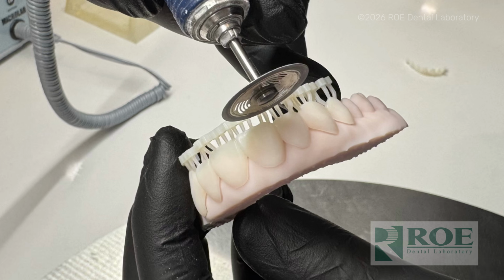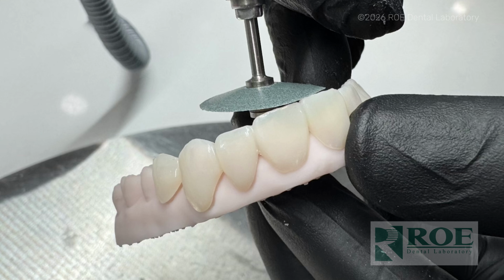So what I always do is, I'll usually be able to print a model. If you have two printers, you can print a model and that makes it easier to process. But I'm going to use a disc wheel to remove the supports, because if you just tear these supports, sometimes it'll create a little divot, and these are on the incisal edges. So I don't want to change my final prototype. For a lot of other things, I'll rip it off, but for these trial smiles and prototypes, I don't do that. So I'll use a disc, cut them off, and then we just use a little, this is a Meisinger, actually this is Brasseler, temporary rubber diamond impregnated wheel. It works really good. But you remove the base of the supports.